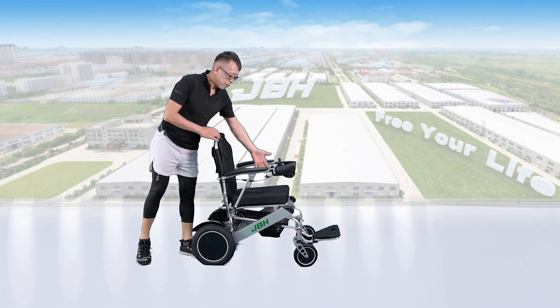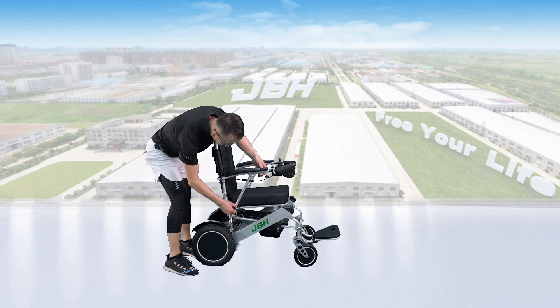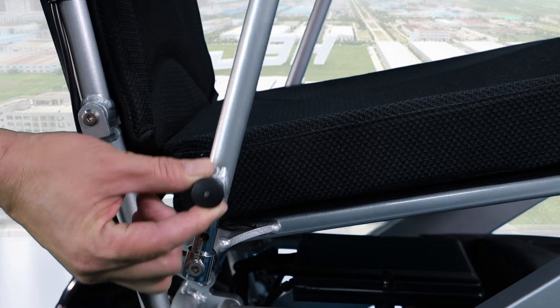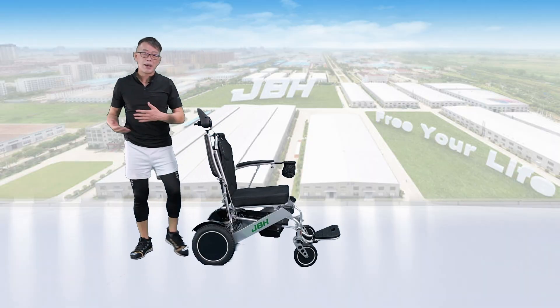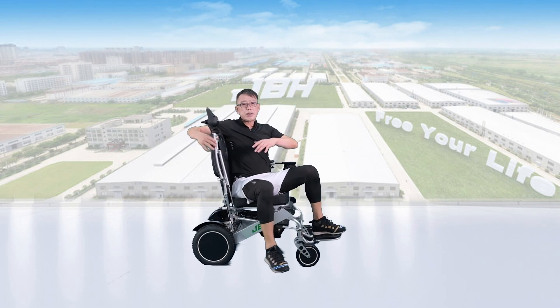We can access the wheelchair from the front or from both sides. If you want to go through the sides, just lift the knob and then flip out the armrests to allow access to the wheelchair. Then put the armrests back when done.